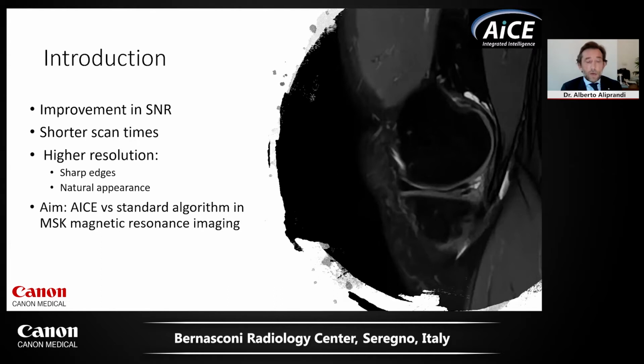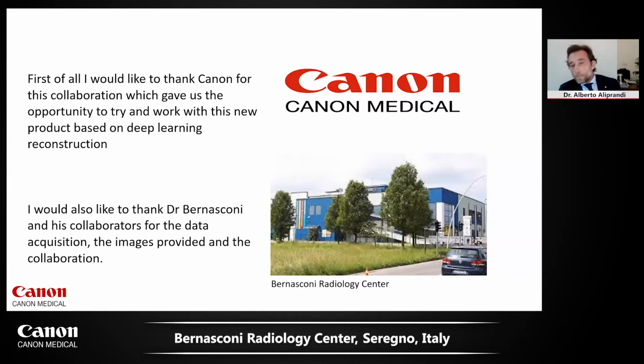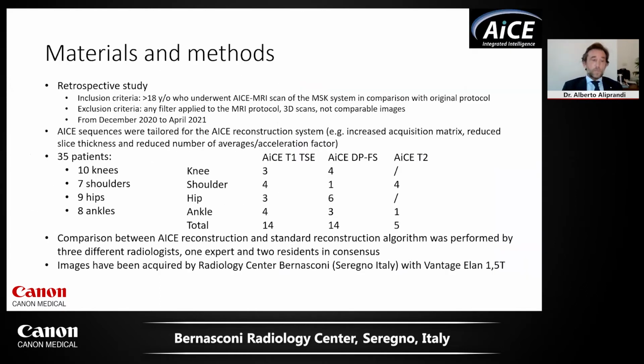So, the purpose of our study was to evaluate the diagnostic performance of advanced intelligent Clear IQ engine reconstruction in MSK MRI compared to the original protocol. We retrospectively evaluated MR imaging of all patients who underwent MRI examination of MSK system with AiCE acquisition at Bernasconi Radiology Center in comparison with the standard protocol.